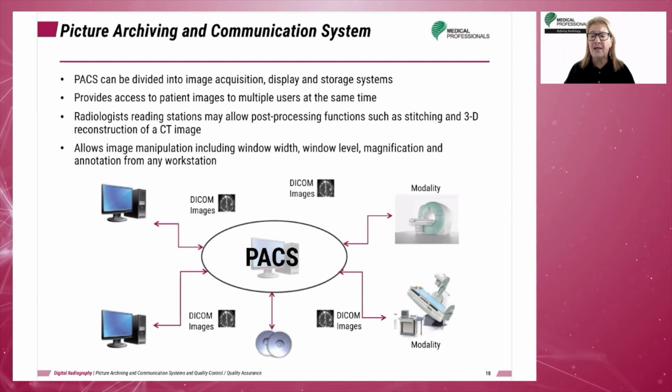Implementation of PACS has eliminated these problems. PACS allows for image manipulation and simultaneous viewing of images from a number of workstations. Referring physicians, consulting specialists, and radiologists can now view images from different locations and perhaps more effectively reach a diagnosis and a treatment plan, leading to better outcomes for the patient.